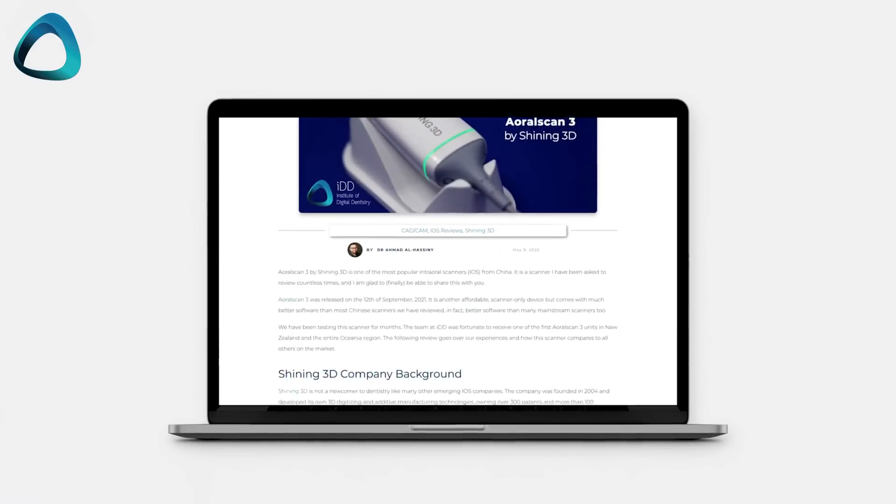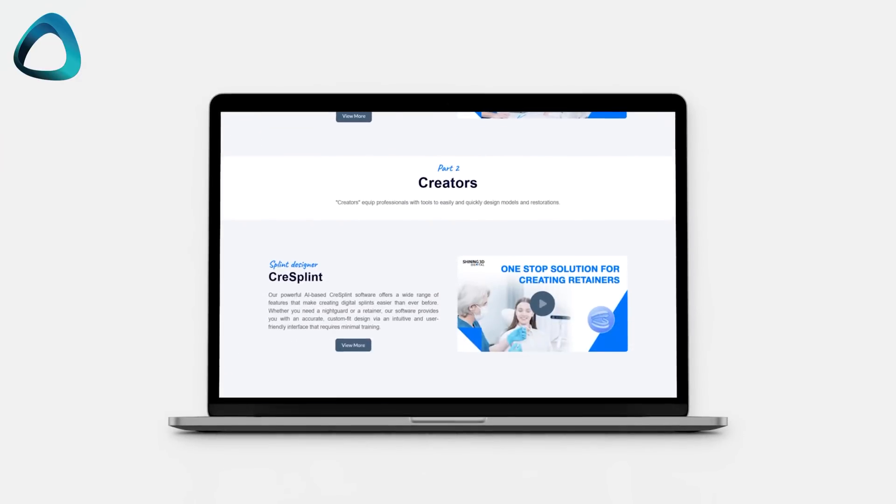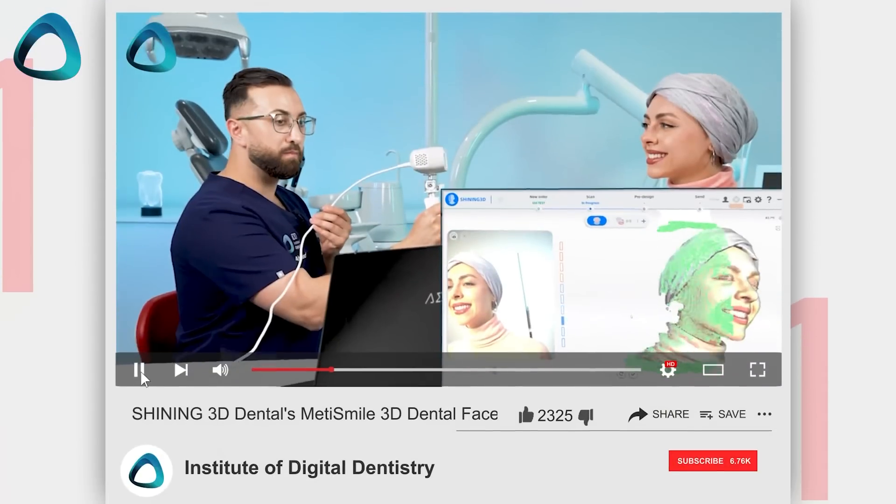This is the Shining3D Aoralscan 3 wireless. It's essentially the same as the previous generation Aoralscan 3, but now wireless. This Aoralscan 3 is a scanner I have already reviewed, and you can check that out on the IDD website. For those who may not know about it, it's basically a really good economic option from China, and it is probably one of the best intraoral scanners from that region. Shining3D also makes other digital dentistry solutions, like a 3D printer — the AccuFab — and a facial scanner, the MetiSmile, which I've already done a full video review on.